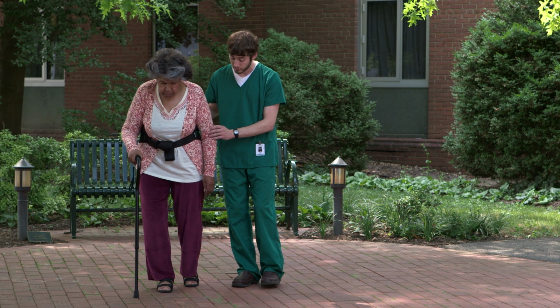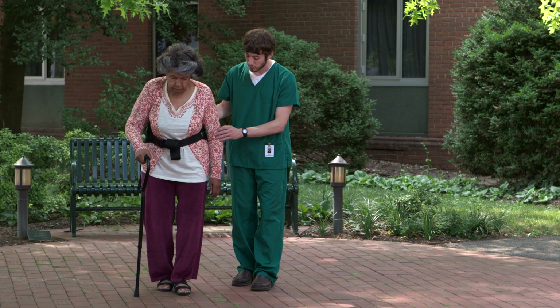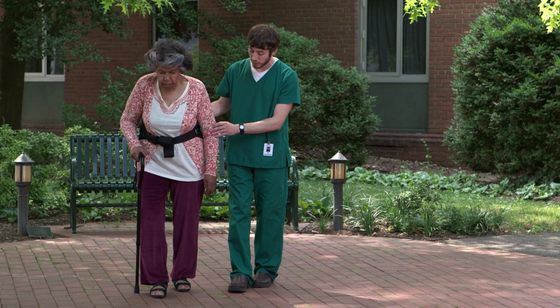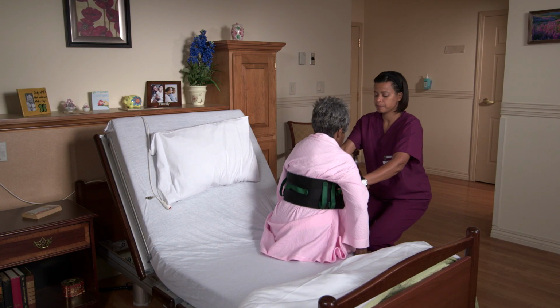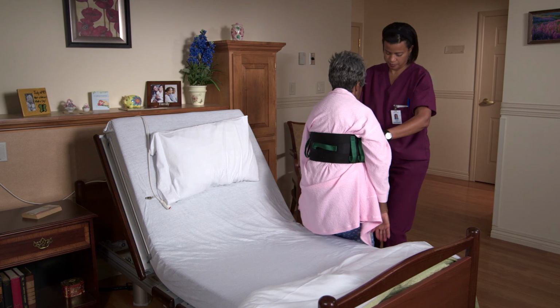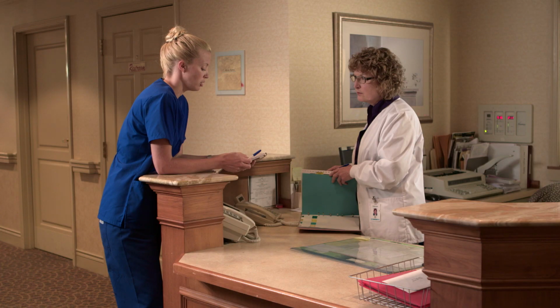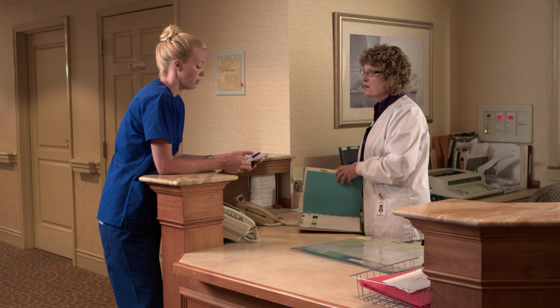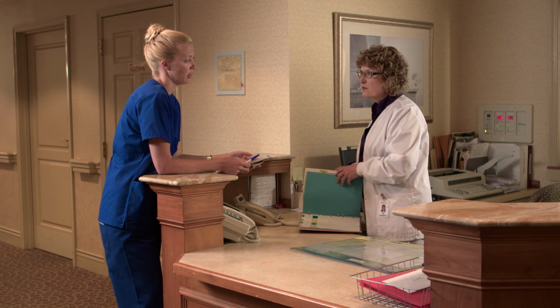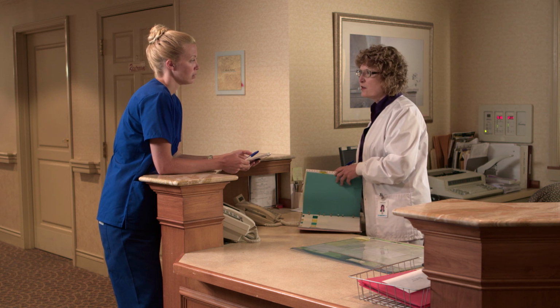Also, be aware of factors that can cause temporary increases or decreases in the person's blood pressure, such as exercise, emotions, time of day, or a change in position, and report these as well. If you measure a blood pressure that is significantly higher or lower than the person's normal blood pressure, be sure to report this to the nurse.